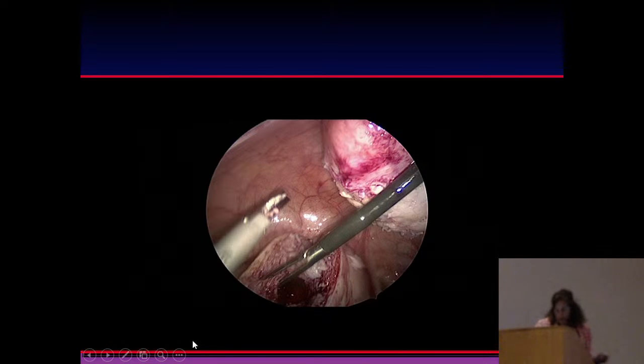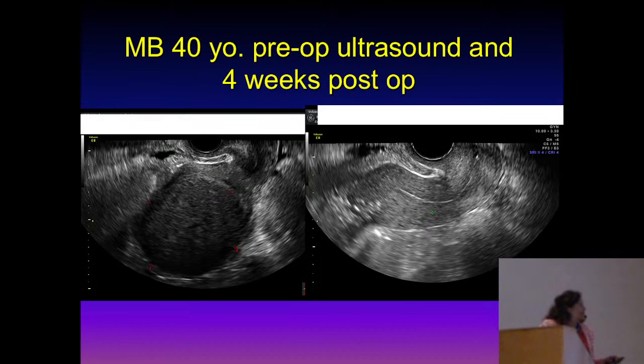So you know exactly where you lose that tactile feel. Laparoscopically, you have to map them and know exactly where they are placed. So here you want to make sure that you close the cavity in layers, and you don't want to get suture in the cavity. And another example of this is ideal, not entering the cavity.